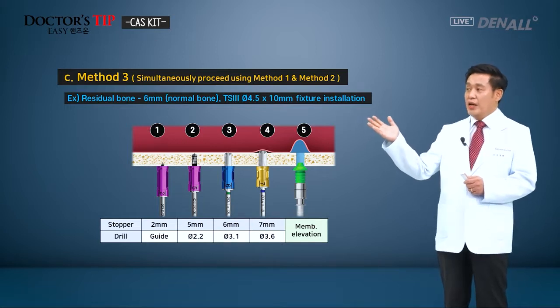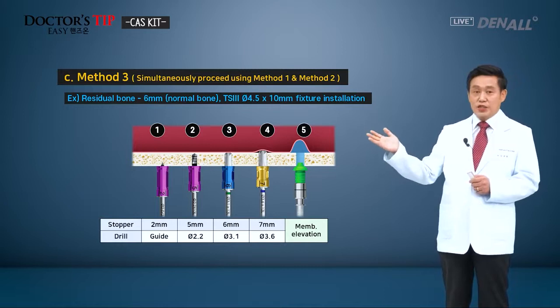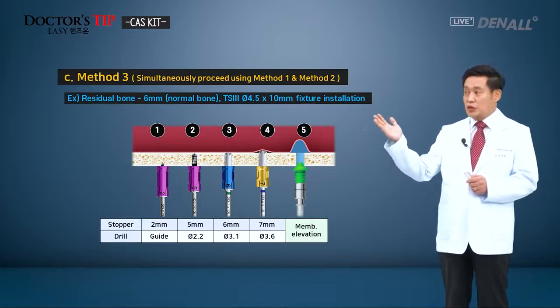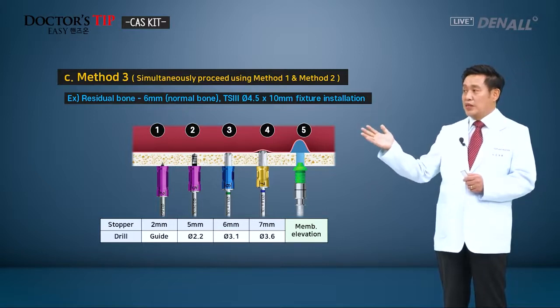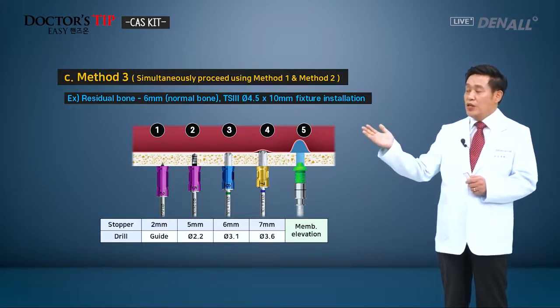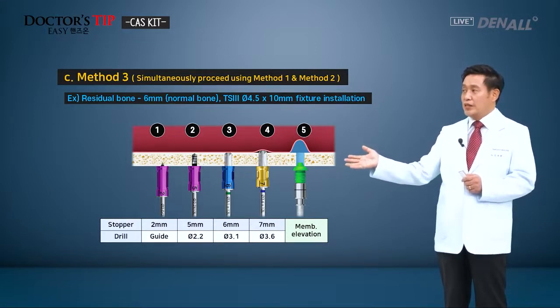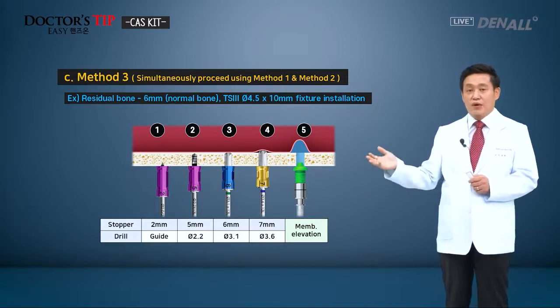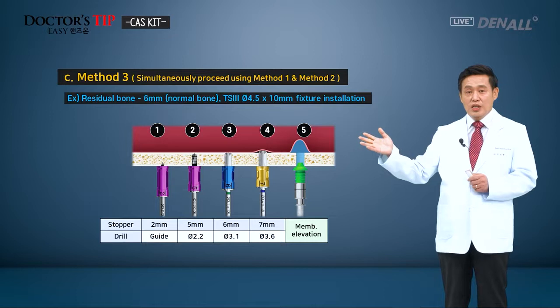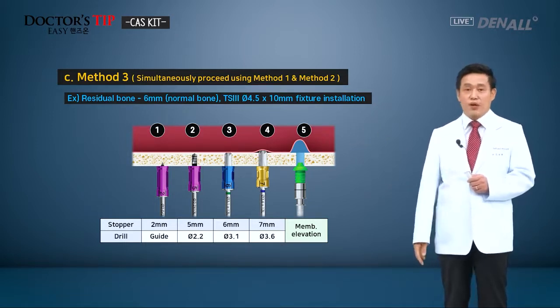Like this, at the beginning, a 2 millimeter stopper is used for the guide drill, 5 millimeter, 2.2 twist drilling. After that, CAS drill 3.1 with 6 millimeter stopper, then 3.6 with wider diameter and longer length is used. Then the drilling sequence is simplified, followed by the hydraulic elevation of the membrane.